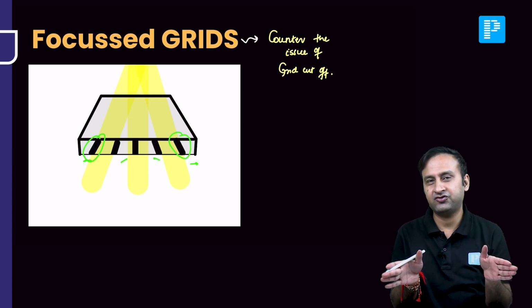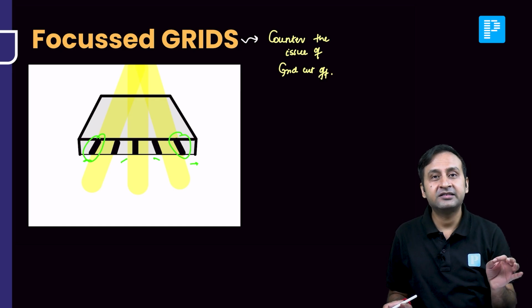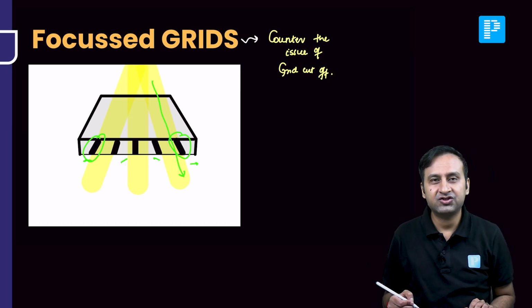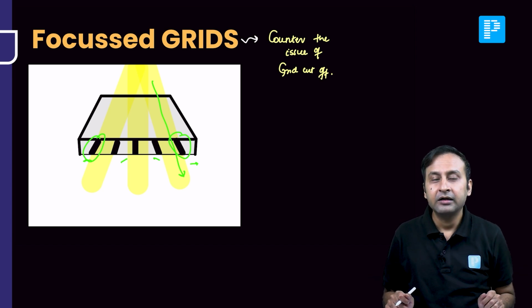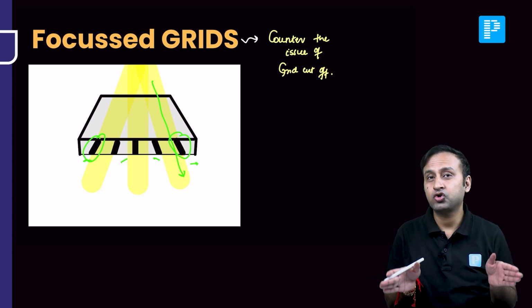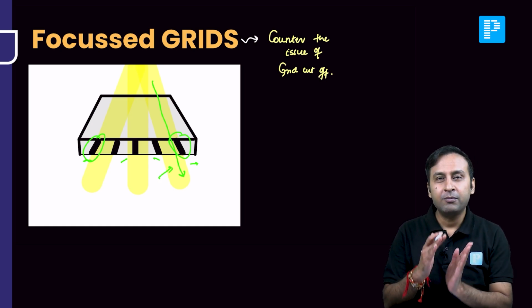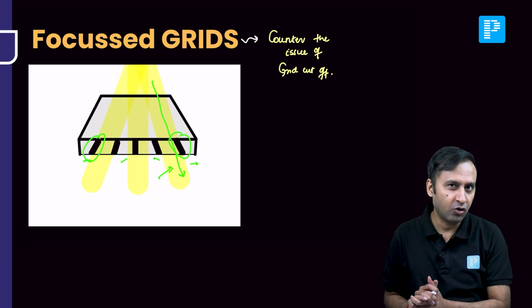The orientation also becomes slanted or oblique. This is done specifically to align them with the X-rays which are extending along the periphery of the grid. The direction of this primary radiation is also oblique, and it is going to conform to this oblique shape of the radio opaque material kept along the peripheral aspect of the grid.